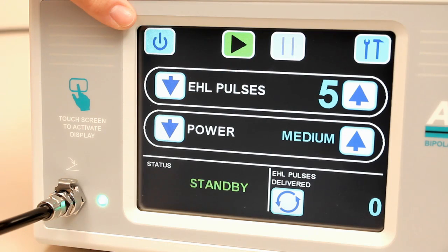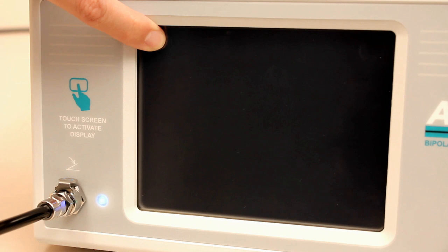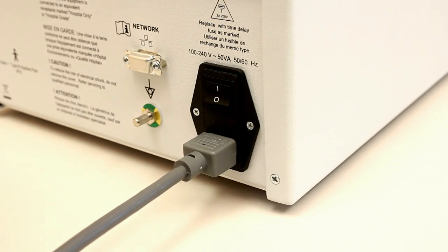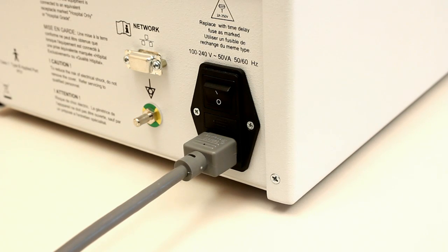When finished for the day, the unit can be powered down by depressing the power down icon at the top left side of the main operating screen. The green LED changes to blue when this occurs. The unit is still powered but is no longer active. To activate the unit once again, simply touch the front of the display screen. This activates the display and readies the unit for use. If desired, to turn off power from the unit entirely, depress the main power switch located on the back of the unit.